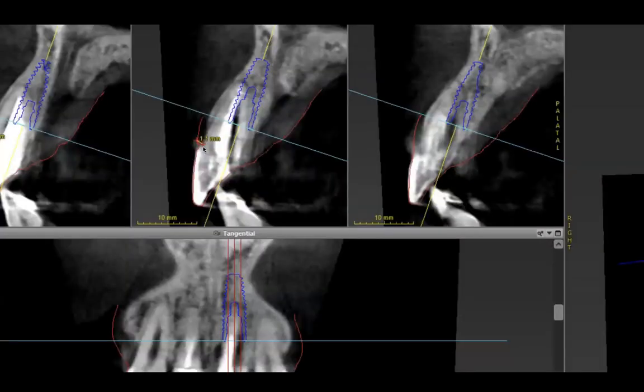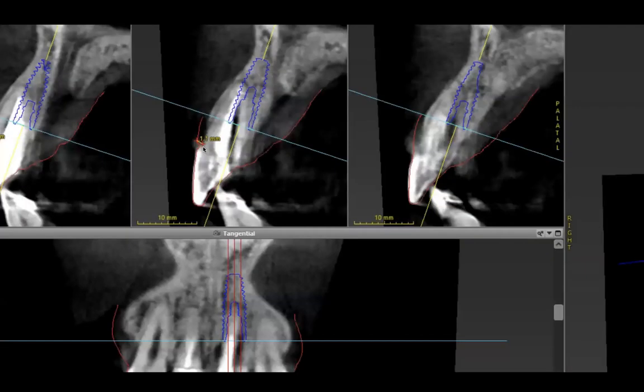You can measure it today with the new software that we have, and we can see that it is above 1.1 millimeter, meaning it's above 1 millimeter, the cutting point that Dr. Khan has placed. So we know that this is a thick biotype. What we are seeing on the composite, the change of the shape of the tooth, has affected this. So now we know with accuracy that this is a thick biotype. And according to this, we have a good buccal plate and a thick buccal plate.